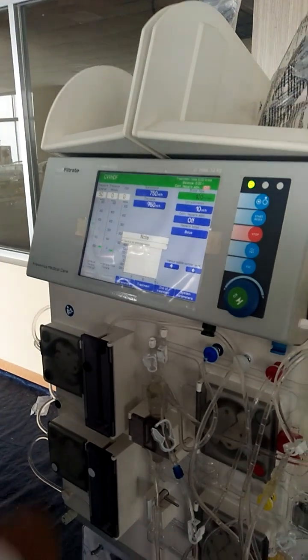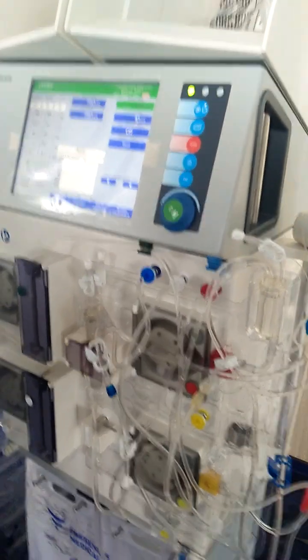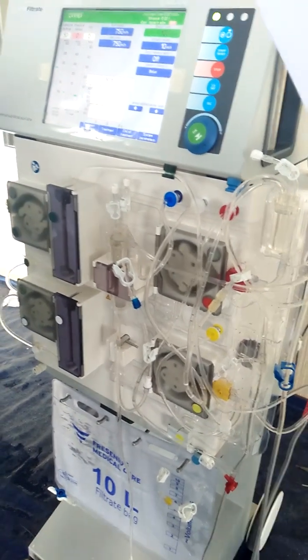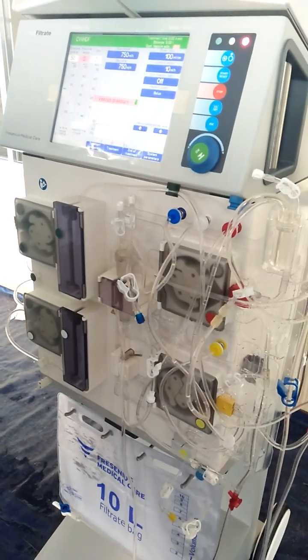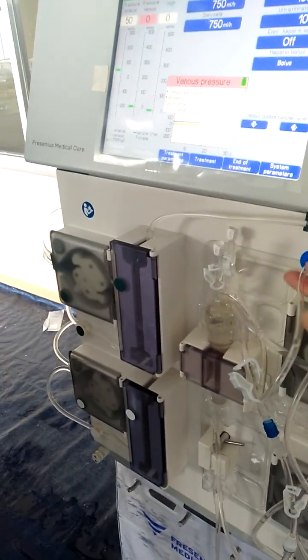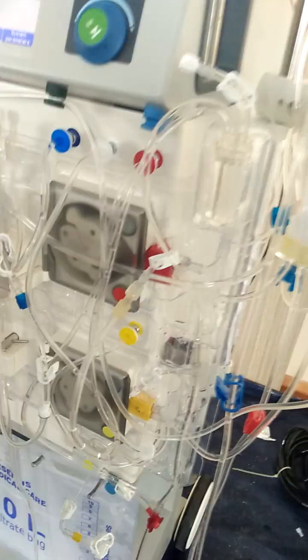Anticoagulation. So you're asking for heparin. Yes, there's no anticoagulation yet. Okay, we'll do this later. So after 10 minutes, the machine will pop up a message. So at that time, because this is wet, that's why you need to remove the water here.